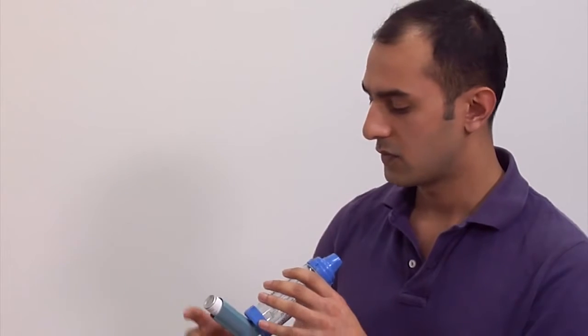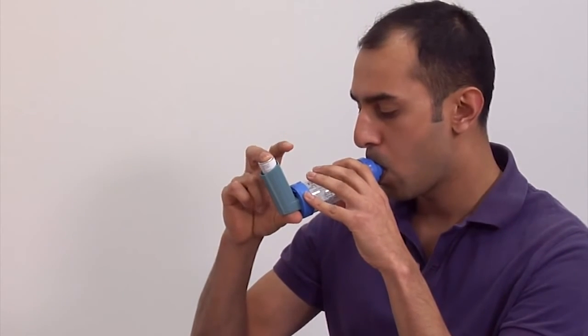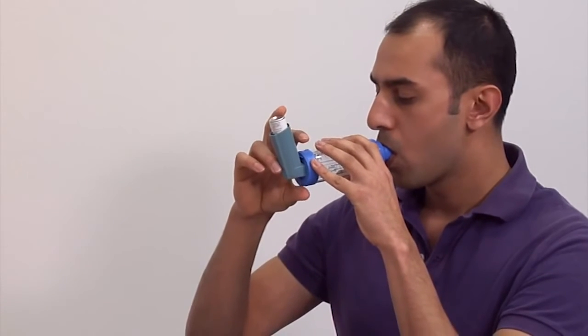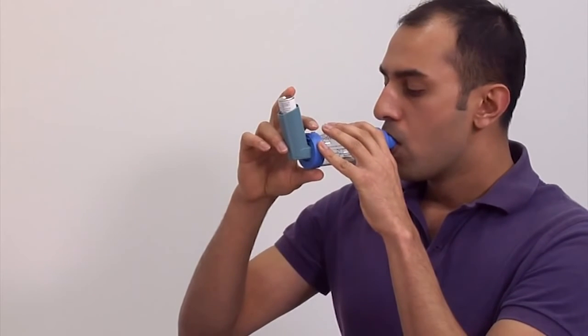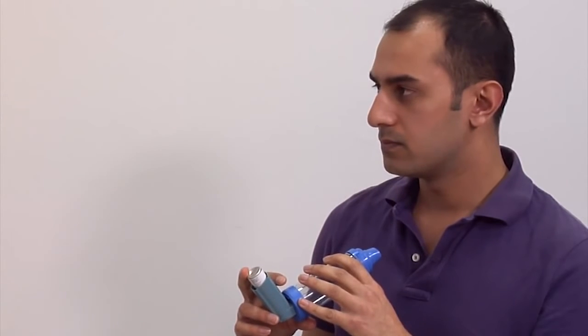Then start to take in a slow, steady breath. Release the medication and continue that breath until your lungs are completely full. Can you try that now for me? And then hold that for 10 seconds. Okay, very good. And so the good thing about this device is that it'll make a whistling sound if you're breathing in too quickly.